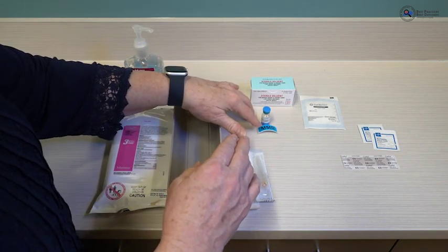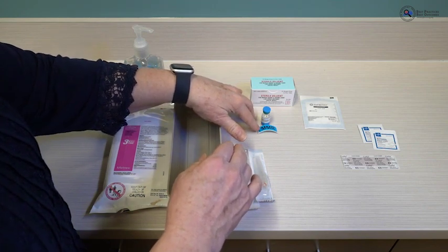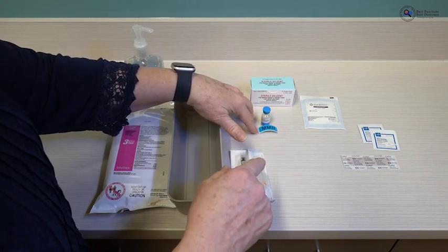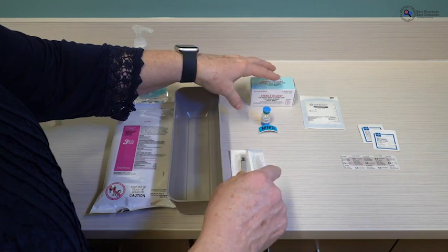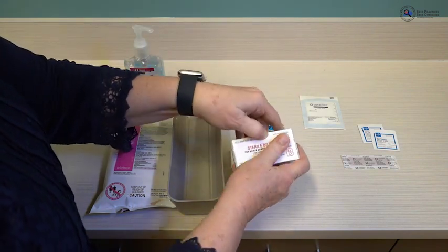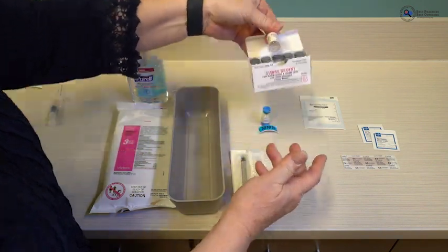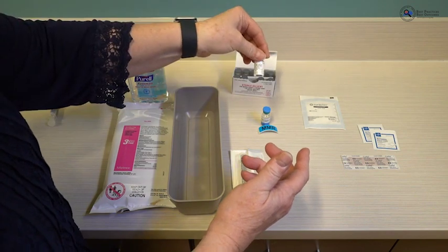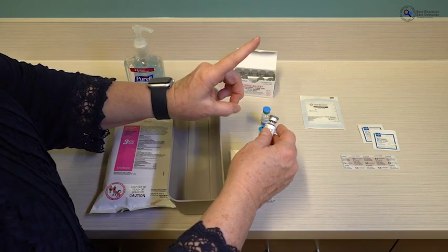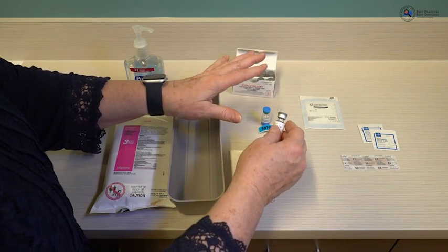It's very helpful to have a label — not only to show what you have prepared and what is in the syringe, but also to add elements such as the date and time of preparation. One vial of diluent is used for one vial of vaccine. Once it is prepared, it is one dose — a single dose — so anything left over you will not save; you will discard.